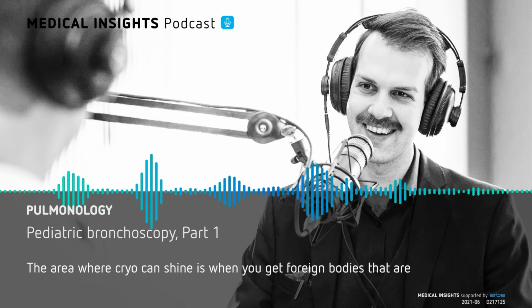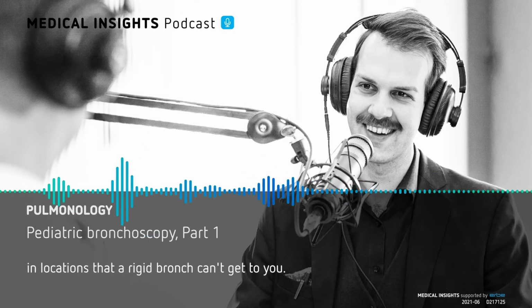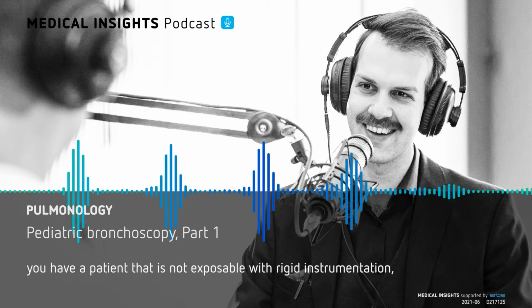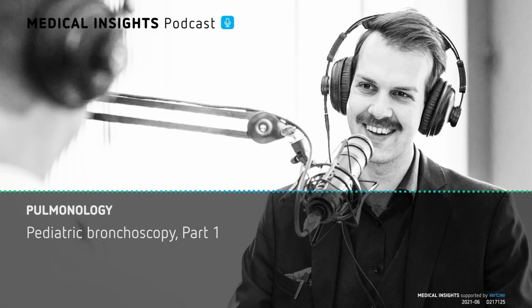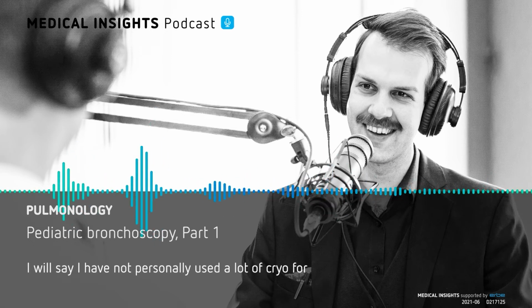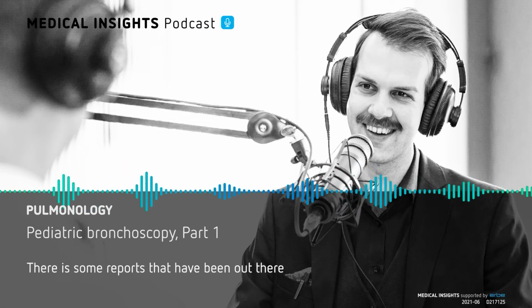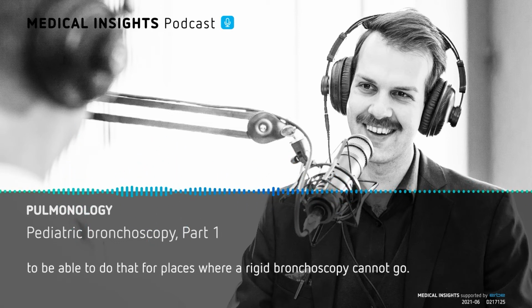The area where cryo can shine is when you get foreign bodies that are in locations that a rigid bronch can't get to. So as you start getting into lobar and segmental bronchi, or say, for example, you have a patient that is not exposable with rigid instrumentation, which is a problem that we run into not infrequently, that is an opportunity where cryo can be quite useful. I will say I have not personally used a lot of cryo for removal of foreign bodies. There are some reports out there where people have been able to do it successfully, but there is an opportunity to do that for places where a rigid bronchoscopy cannot go.